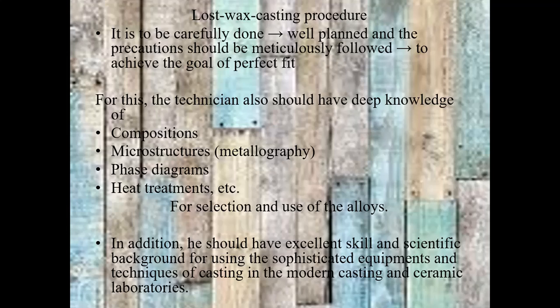So the technician who is performing this casting procedure should have a deep knowledge of the compositions of the materials which he is using during the casting procedure. That is about the alloy, about the investment material, about different materials which he is using, everything. Now also he should have deep knowledge about the microstructures, about the phase diagrams and heat treatments, etc. And based on all these, that is for selection and use of the alloys.